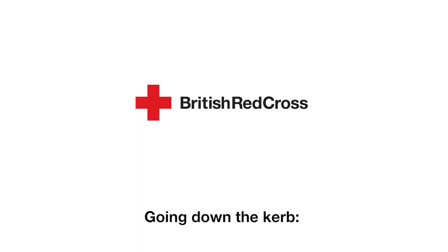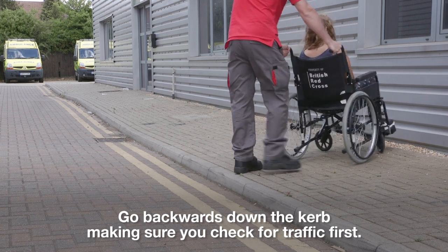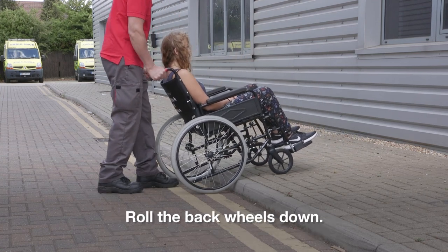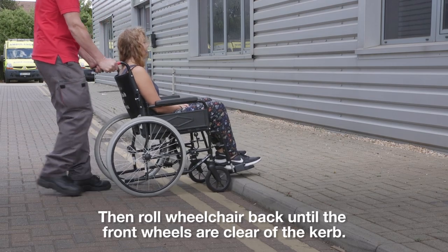Going down the kerb. Go backwards down the kerb, making sure you check for traffic first. Tell the person in the wheelchair that you are going down the kerb. Roll the back wheels down, then roll the wheelchair back until the front wheels are clear of the kerb.